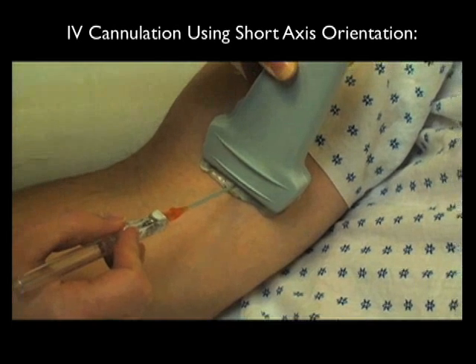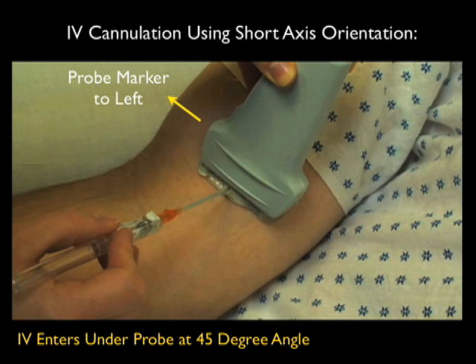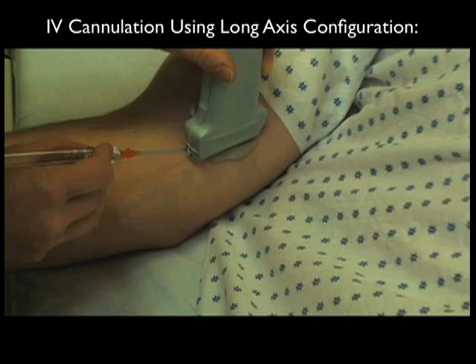Here's an example of an IV cannulation using a short axis orientation, which is the preferred primary orientation for placement of a deep peripheral guided IV. Notice here the probe marker is configured to the left to orient to the screen indicator dot, which is also configured to the left. The IV would then enter underneath the probe at a 45 degree angle. As the IV goes in underneath the skin and more proximally up the arm, it's important to move the probe a little bit more proximally to stay in line with the tip of the needle.